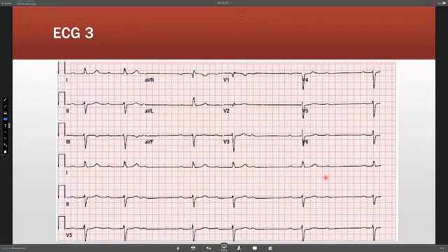Now, at times you have a transient high grade block, and depending on the pause, you don't have a ventricular escape rhythm. Then conduction starts back with AV conduction, without saying what the underlying ventricular escape rhythm is. That can be very long, and the patient can have symptoms like syncope, or it could be very short, as short as 2 beats. So I think it's a spectrum, Khalid. I don't know if there's any specific way you can define this or that. I think both are bad, and you need to take them in context. As long as there's no other reversible physiological explanation, both of them need to be taken quite seriously.